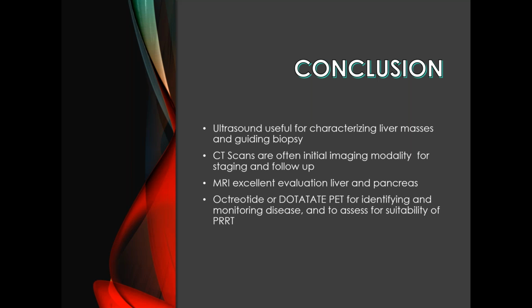Yeah, I have a personal experience with differences between the size of tumors measured on an ultrasound versus an MRI, which I think would make a little bit more sense. But MRI to MRI, I can understand the concern. Yes, exactly. The other thing is, with MRI, if they took the measurement on a different image sequence, it can also affect the measurements. I see. Okay, that's good to know.